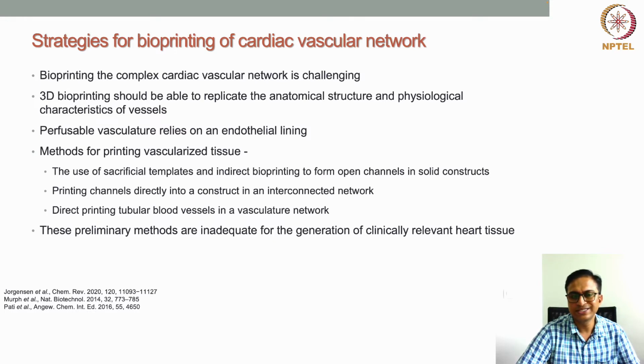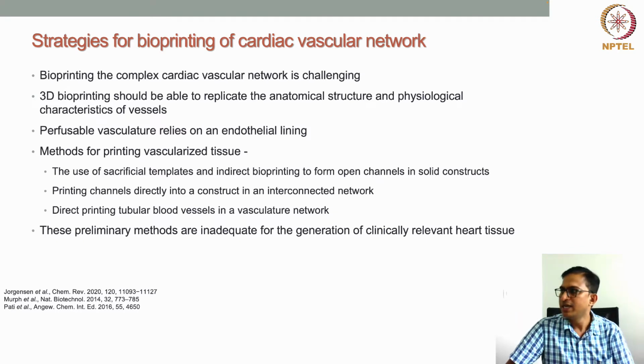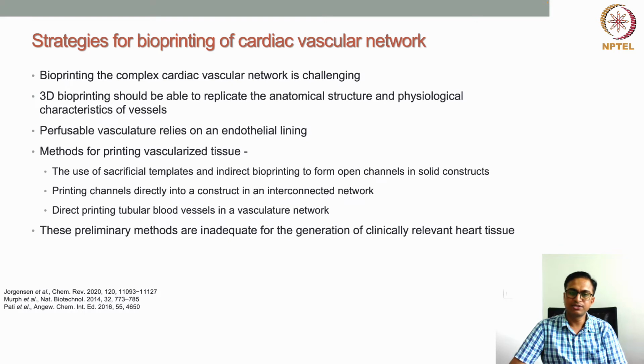And we have also seen indirect bioprinting. We have already discussed in our earlier lectures, where the use of a sacrificial material is very important, and the sacrificial template is used to form open channels in the solid construct. Suppose we print within a hydrogel. In the hydrogel we print the sacrificial template first, then we put the hydrogel in, and later on that sacrificial material can be taken away, but it will leave a vascular network structure or a channel structure.